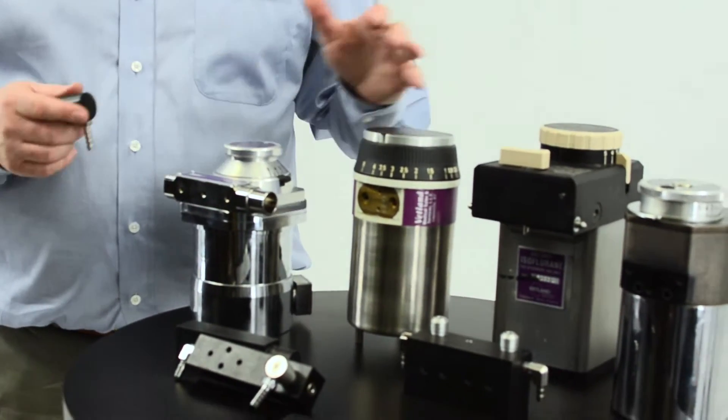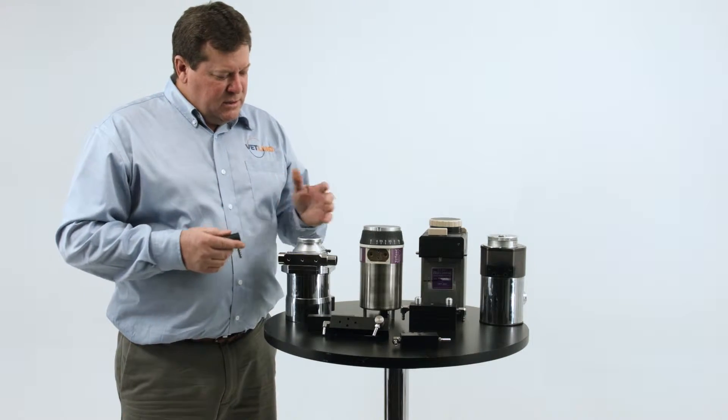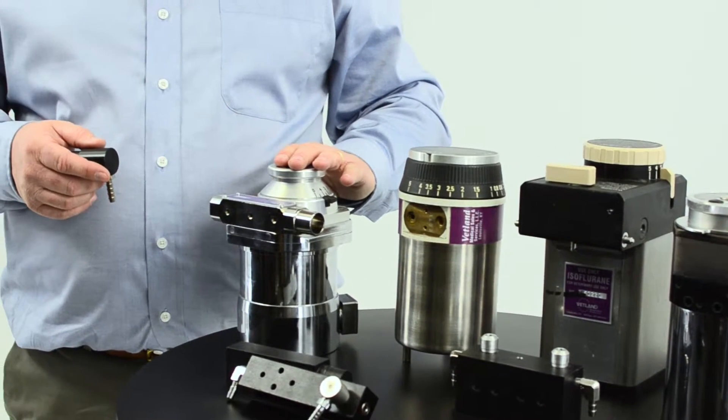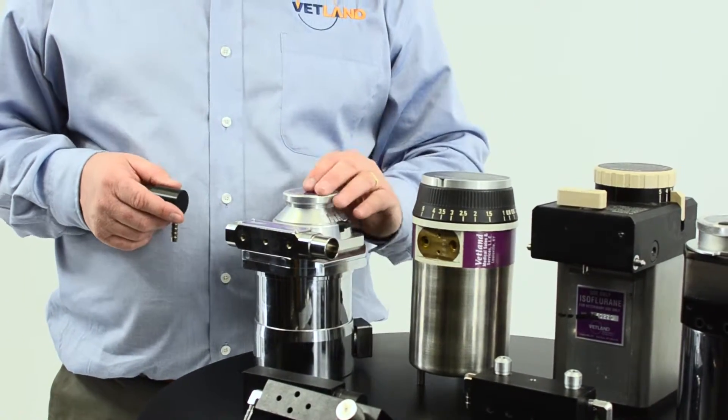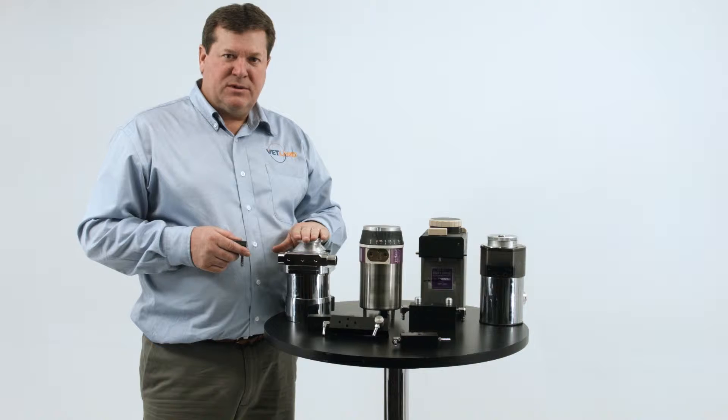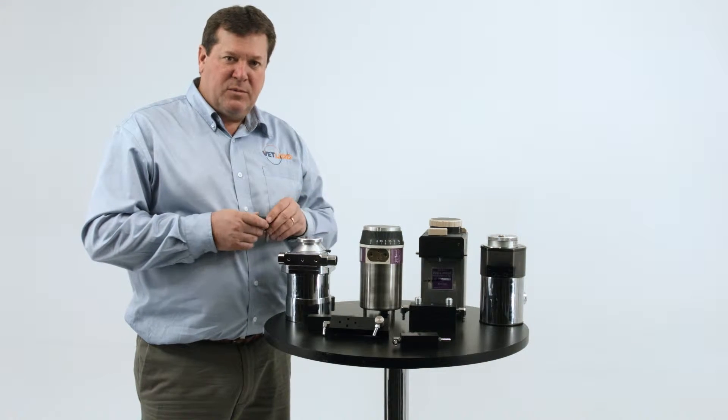Every vaporizer has to have an interface between the vaporizer and the anesthesia machine. On the TEC-3 vaporizer, that manifold or interface is actually built in. It's part of the vaporizer. So if you purchase this vaporizer, it's not necessary to purchase an additional manifold.